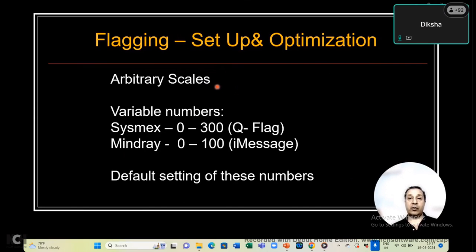And depending upon the XYZ coordinates, you are able to define its location within the scatter plot. Now, when you define a particular threshold beyond which this dot plot is giving you a variable number, you are identifying that variable as a cutoff for you to flag it up as something which is not falling in the right place.